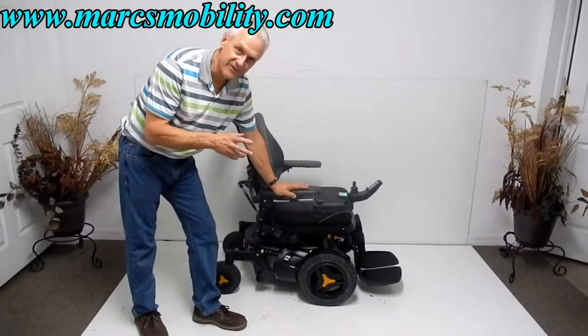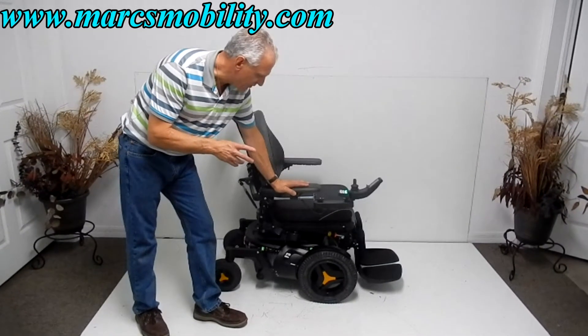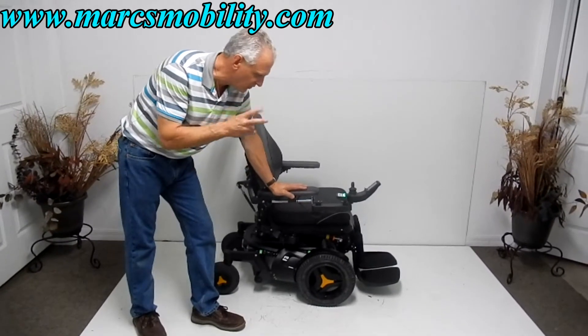This is a Permobil F3. This is the newest power chair that Permobil came out with, about a year and a half to two years ago.